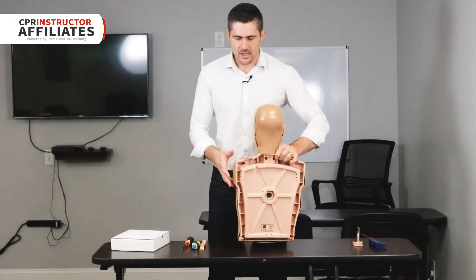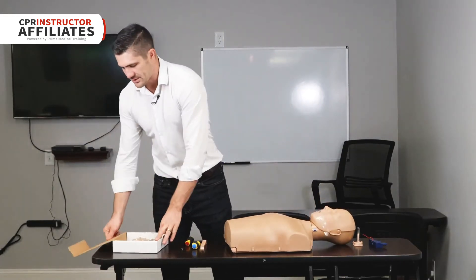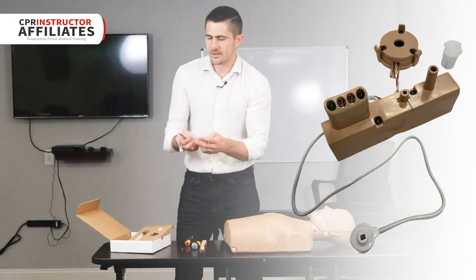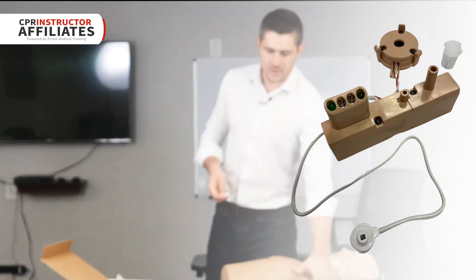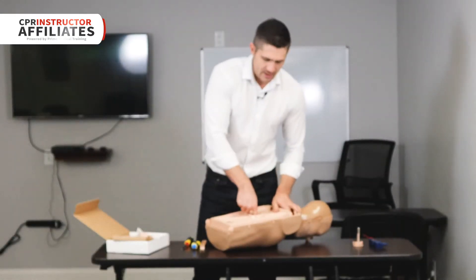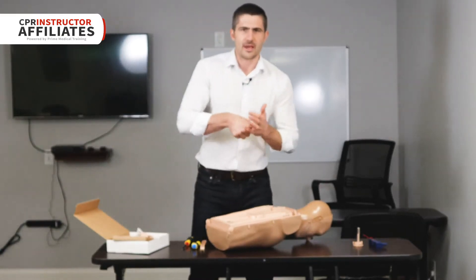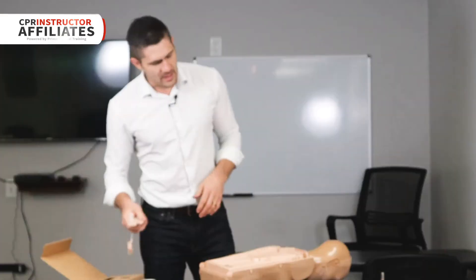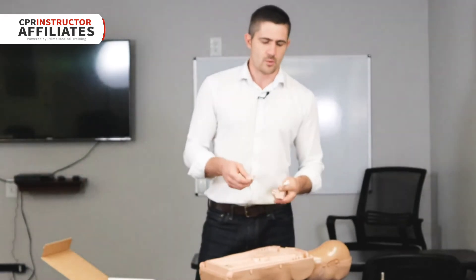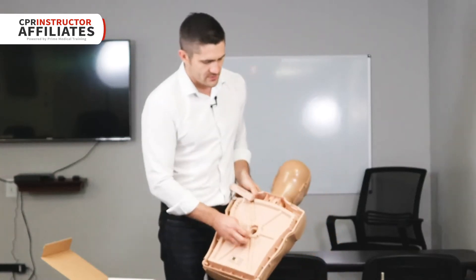Now we're going to open up the conversion kit. The conversion kit has three components: the new light and this plug. The plug goes in first — it goes all the way down the back of the mannequin. Take your finger and just push in, and usually one push and you'll feel it kind of set into place. Then we're going to take the new rate monitor.